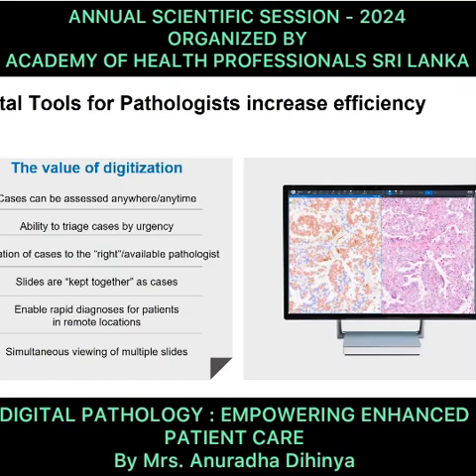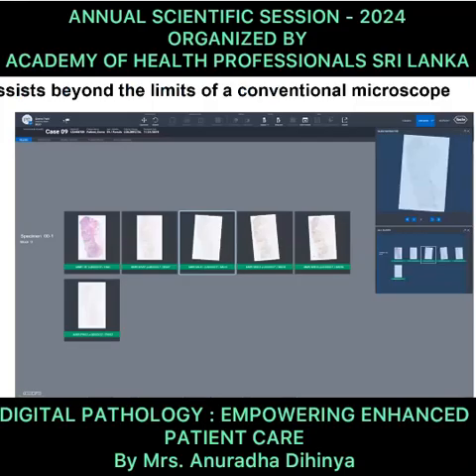The patient doesn't have to move, neither do the slides need to be couriered. And simultaneously, it helps with multiple viewing of slides. Now, when I'm talking about digital pathology, it crosses the limit of the conventional microscope. This is how the digital slide looks.